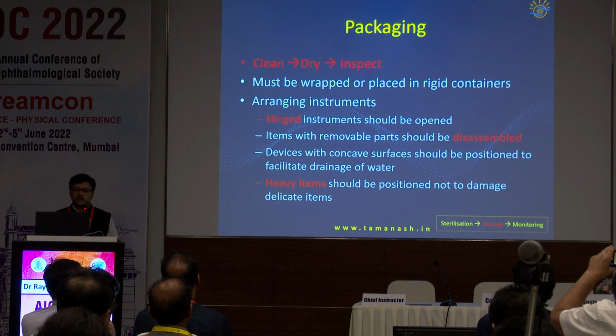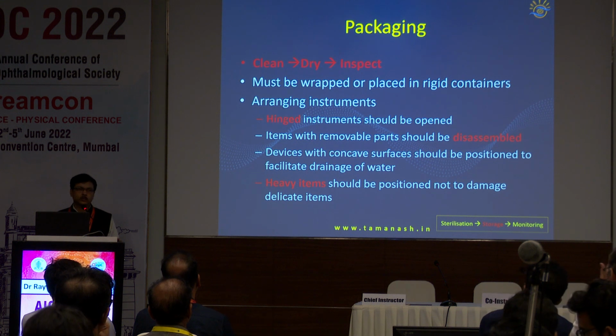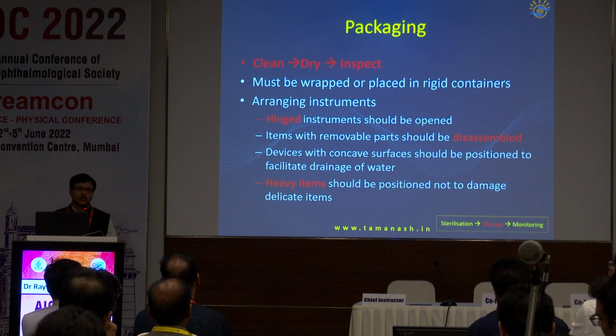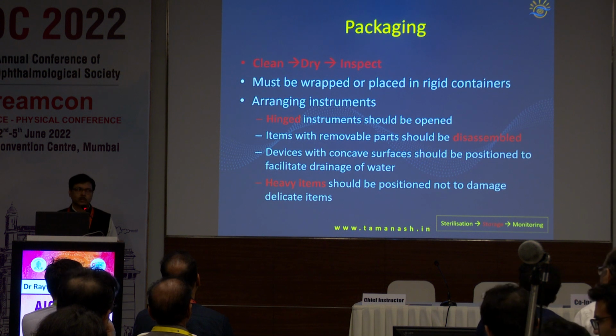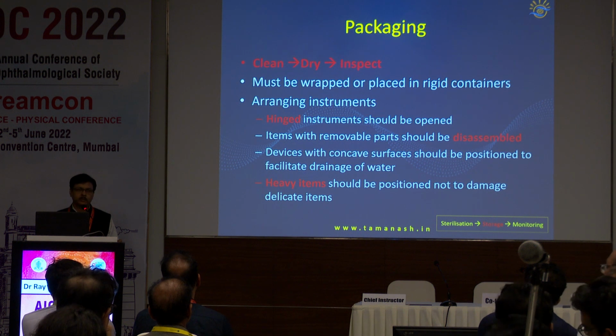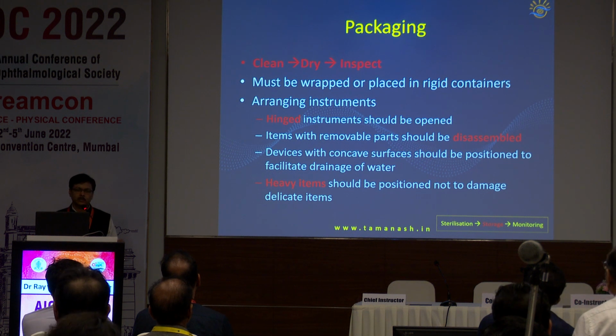So for packaging, Anshuman has already said, but it is very important to disassemble instruments that can be disassembled. So specifically, the phaco tip and sleeve should be opened and separated and autoclaved. They should not be autoclaved in situ. And heavy items should be placed lower because they tend to damage the more delicate instruments like your choppers and Sinskis. So that has to be maintained.